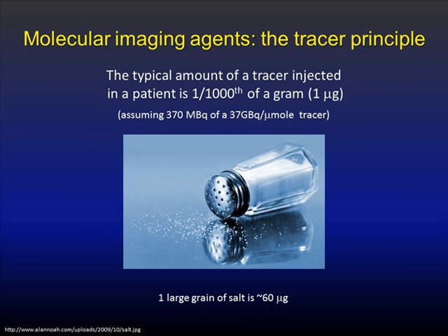Just to give you another feel, you might inject 100 grams, almost 100,000-fold more iodine, if you do an IV contrast CT. So to give you a sense of scale, and that's okay, but we're working at much lower levels than many other contrast agents you might use for medical imaging.